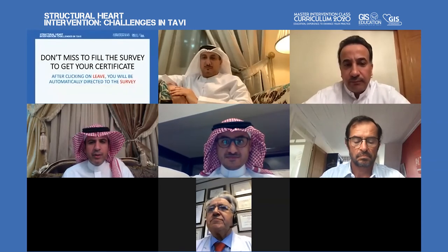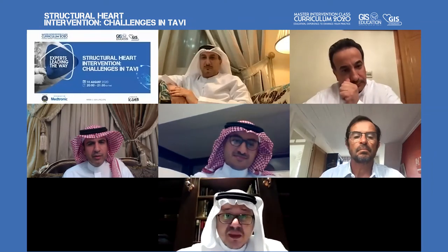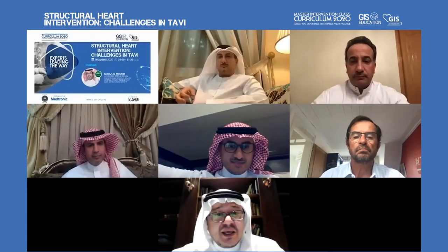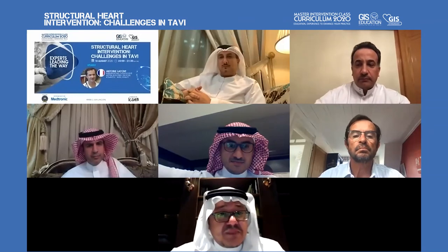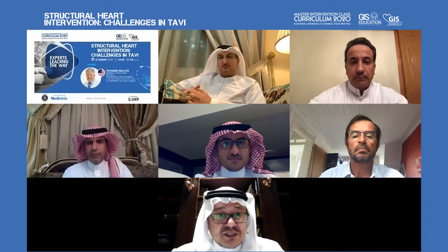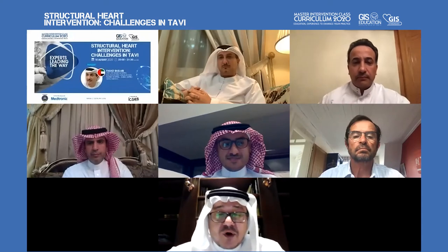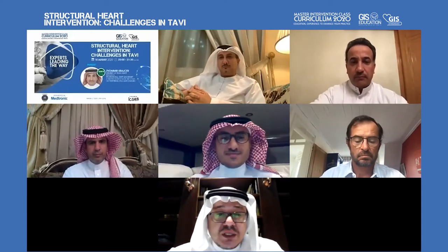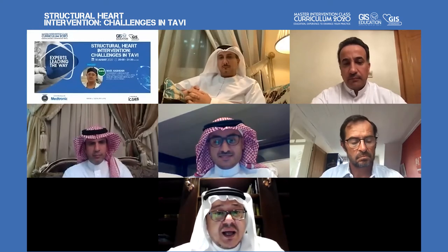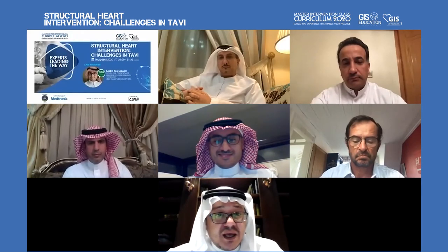Dr. Wael, I have recently seen a lot of cases posted with the cusp overlap. Can you talk about it? It's very important, because we are talking about moderate and low risk patients, that when you do the implantation, you make sure you don't cause left bundle branch block or heart block. And you want to give the patient the best chance of coronary access in the future. The best mechanisms so far for preventing heart block or left bundle branch block are to do a high implantation with cusp overlap, either right anterior oblique caudal, the right cusp overlap, or extreme LAO with the left cusp overlap.